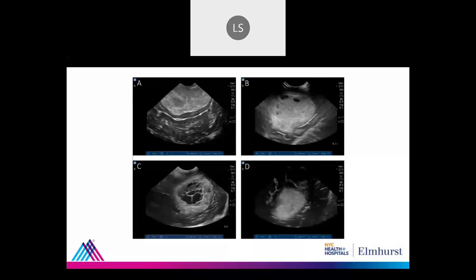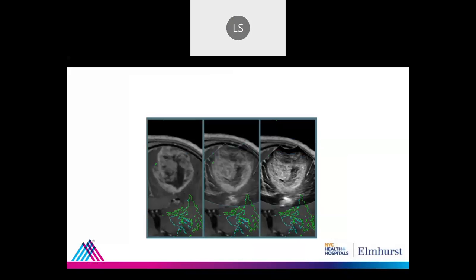Okay, so this is an oligodendroglioma. There you go. That makes sense. This is one of the lesions that has the most diverse appearance. It can look hyper or hypo, but it's pretty frequent to find a hyperintense lesion with no very well defined borders.